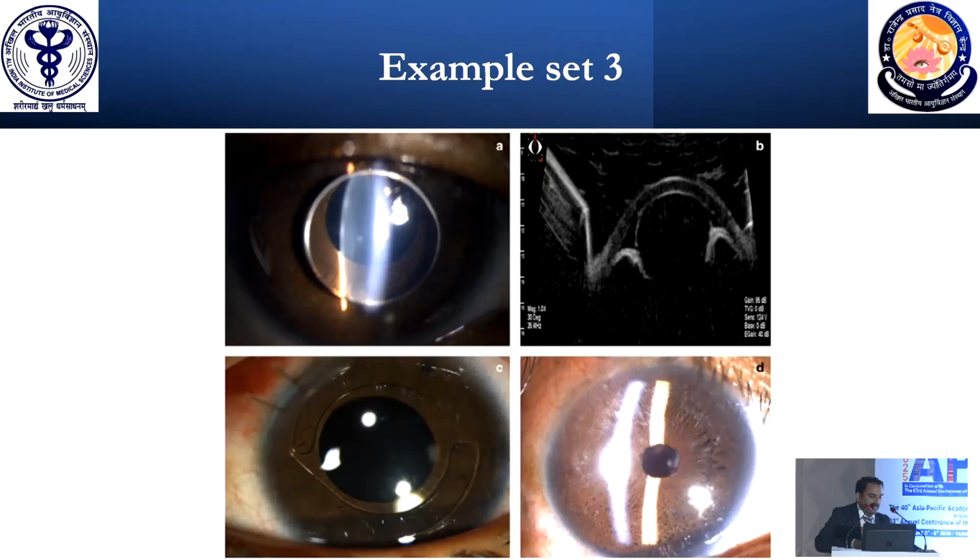So this is one more case with anterior subluxation of the lens because of spherophakia. You can see that the lens is touching the endothelium. These are for educational purpose. Of course, we will see on the slit lamp or during microscope, but that's how you are going to tell the findings to the naive surgeons or the young people who are studying the cases, right?